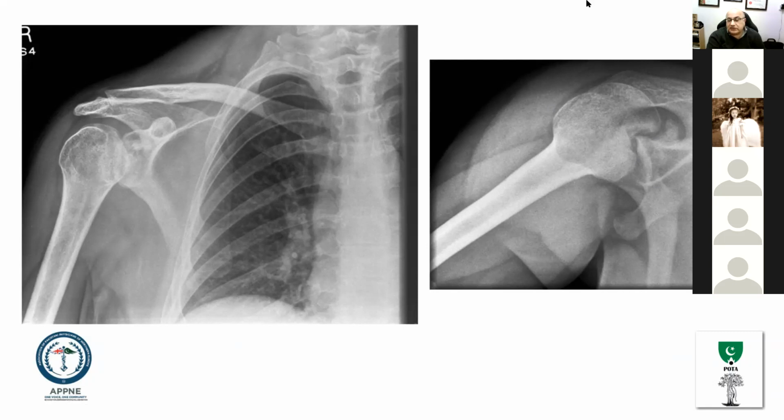The fourth option is you can take a metallic button. They come in different shapes, but they are specifically made for people who are young but who have defects in their humeral head. So you actually put a button in there, which is like a metallic implant, but you still have to do the McLaughlin's, i.e. the transfer of the subscap. Otherwise, it will keep falling out behind the shoulder.